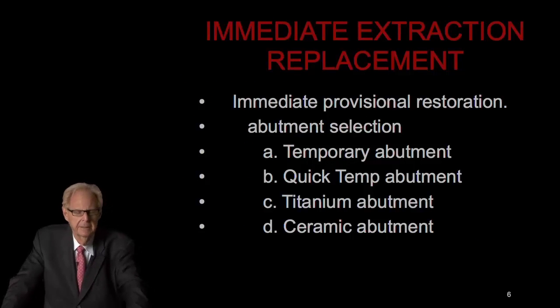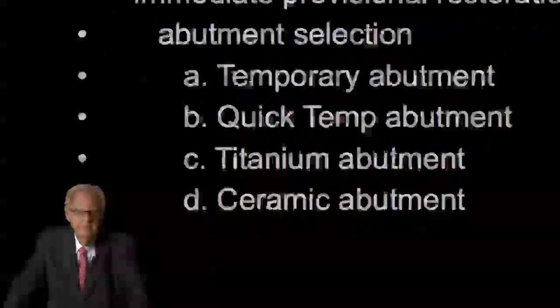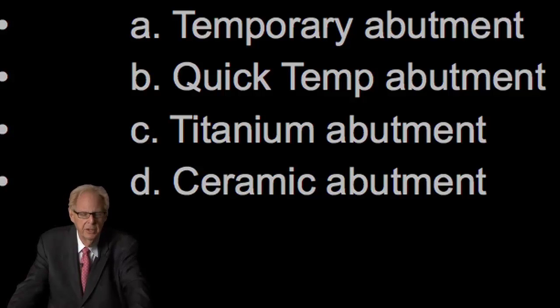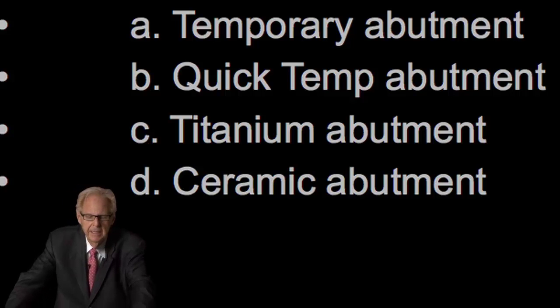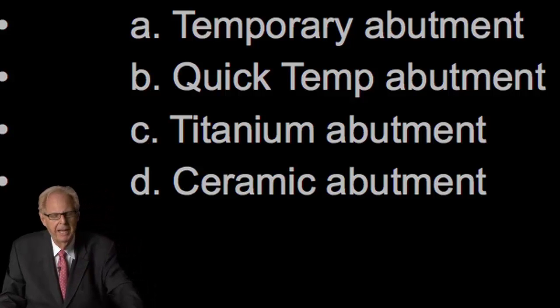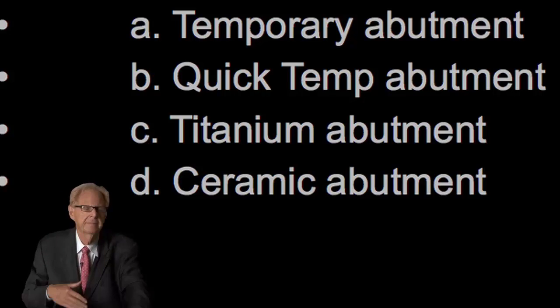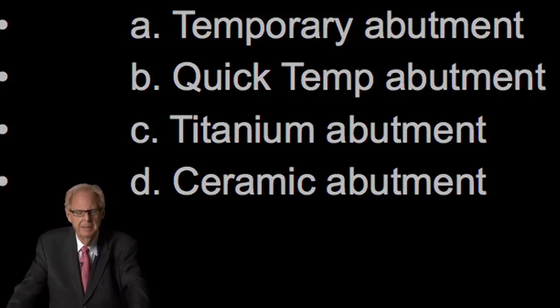So our abutment options for the immediate provisional restoration, we can use specifically designed abutments for temporization. There's a temporary abutment. There's one that's called a quick temp abutment. Those are from Nobel Biocare. Other implant companies, I'm sure, have something that might substitute as temporary abutments.